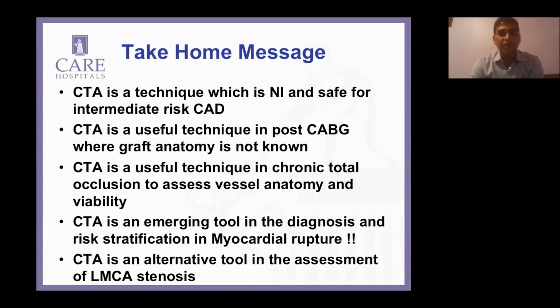Yeah, I'll just try to answer those two questions. So the first technique is, number one, CT is a great tool. It's a fairly easy technique to do. And I would believe it has a huge negative predictive value of nearly 99% if done well. And as cardiologists, I think it's very important when we send patients for CT, we need to know where we are sending and what is the expertise of the lab, because you can get some really dreadful pictures, which do no good for either you or the patient.